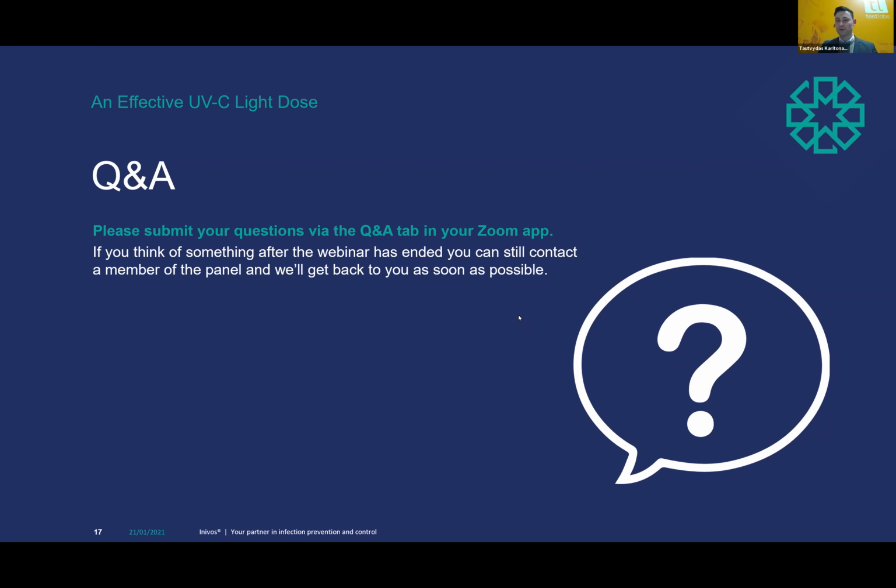Obviously, we won't be able to do that all alone. So we're saying, if we start this conversation, we start this topic, to ask, are we still effective even if we get the same dose? Are there other parameters that we need to consider? So instead of just noting the dose, we note the time, temperature, humidity, anything else that may affect the value. Are we actually training these bacteria or viruses how to resist UVC light? It may seem like crazy questions, but at the same time, we don't want to get in a position where that's a reality that we have to face going forward.